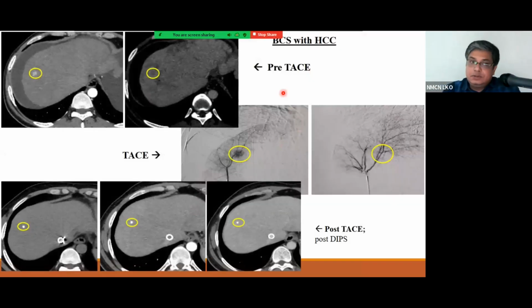This patient also had an arterial phase enhancing nodule in the right lobe of the liver which washed out on delayed venous phase. The alpha-fetoprotein was not in a much higher range, but over a period of 1 year, there was a change from 3 to 7.